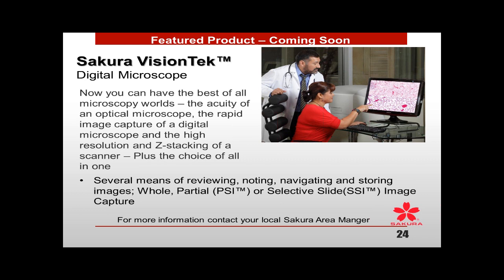So whether it's a histochemical stain, an immunohistochemistry antibody reaction with a counter stain, or an H&E, it will pick up those different entities because they have different refractive indices.